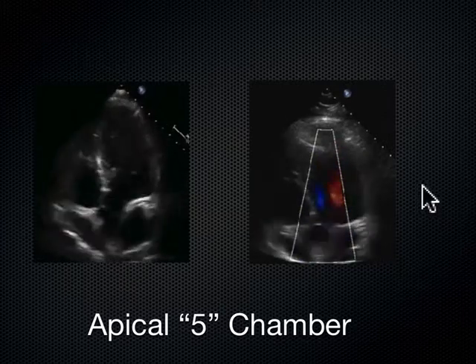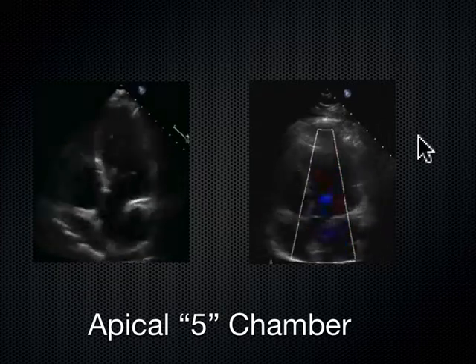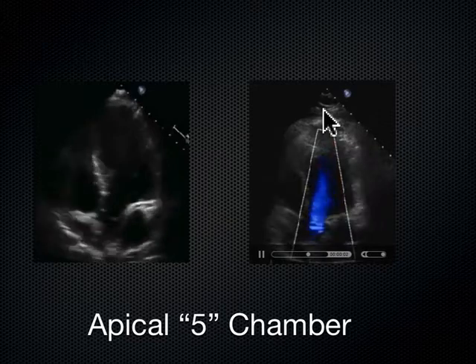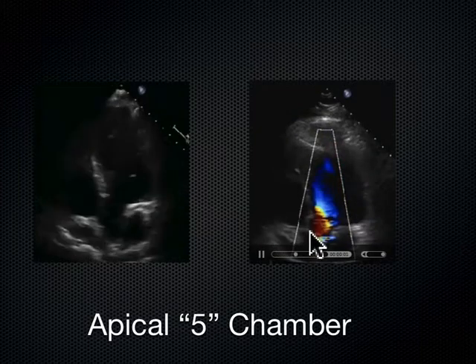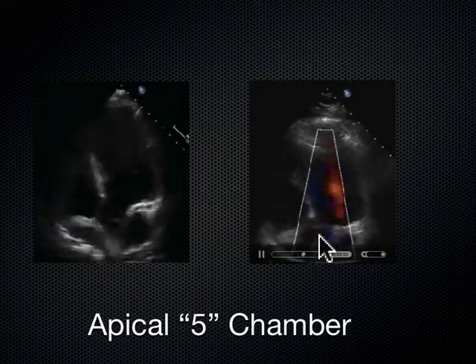And over here, BART, blue away, red towards. We've got the transducer up here along that apex. And during systole, we expect to see blue away right into the aortic valve. That's what we're expecting to see. That's normal because the blood's going through that aortic valve.